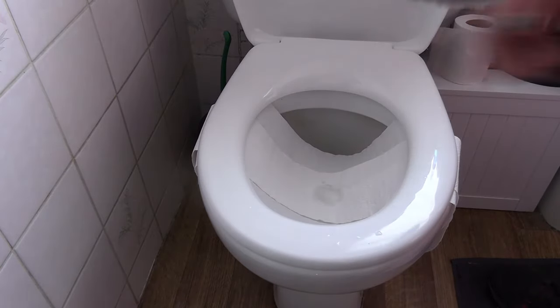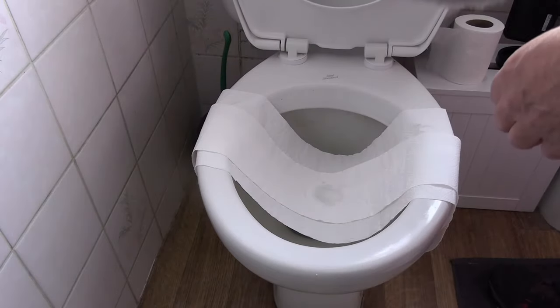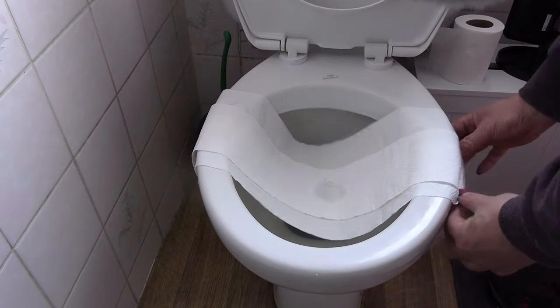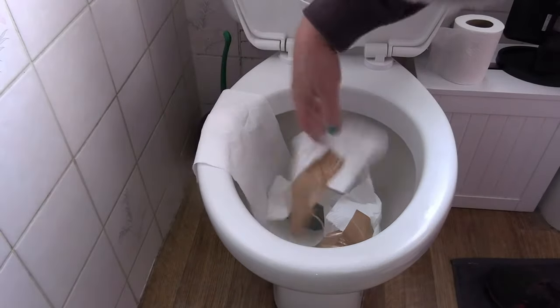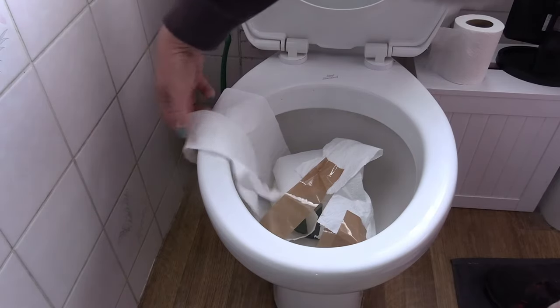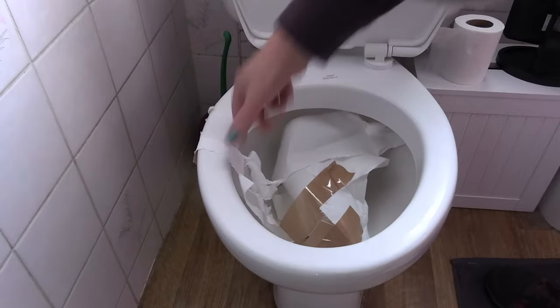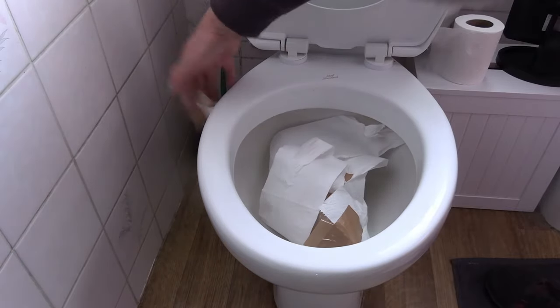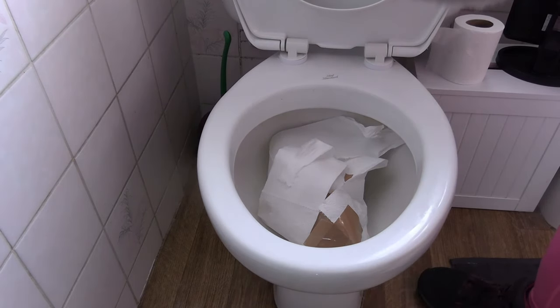Your poop is sitting there. Lift up the toilet seat — don't worry about the tape. See, I did a bit too good of a job. Bye bye poop.